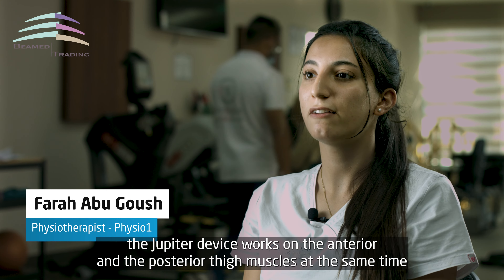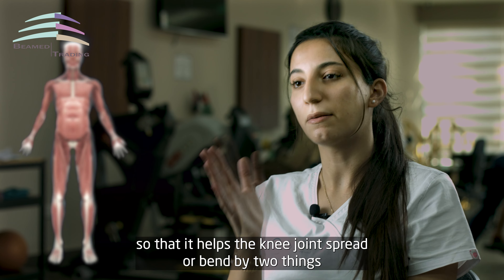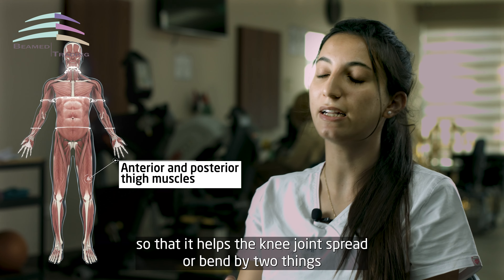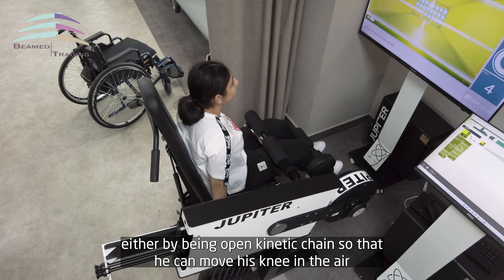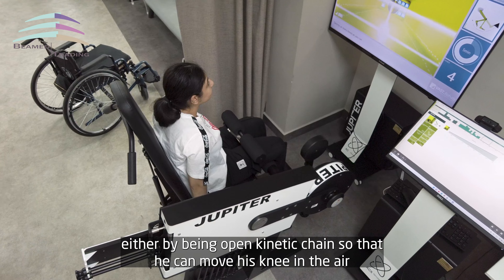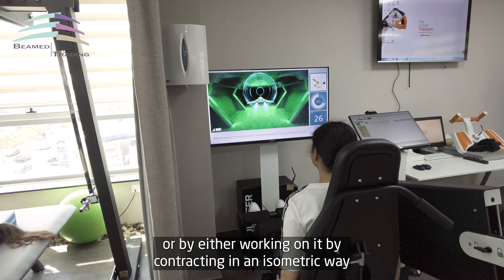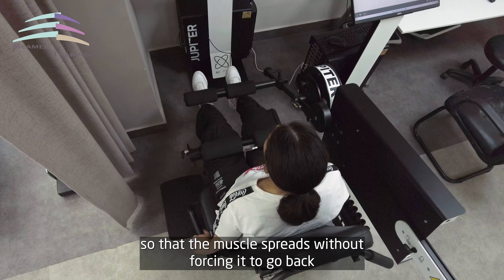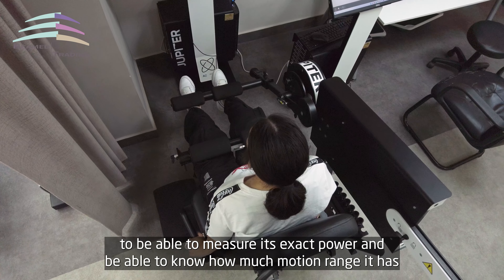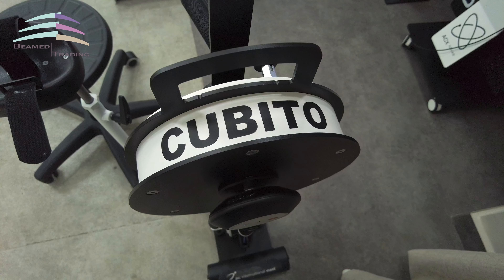جهاز الجوبتر بيشتغل على عضلات الفخد الأمامية والخلفية بنفس الوقت، بحيث بيساعد مفصل الركبة على الفرد والثني. عن طريق شغلتين: يا إما بتكون Open Kinetic Chain بحيث يقدر يحرك ركبته في الهواء، أو يا إما بيشتغل عليها عن طريق الإنقباض الأيزومتريك بحيث إن العضلة بتنقبض بدون ما تضطر تطول. وبالزبط بيقيس الباور تبعها ويقدر يشوف قديش المدى الحركي.